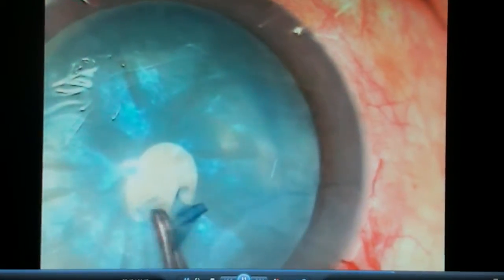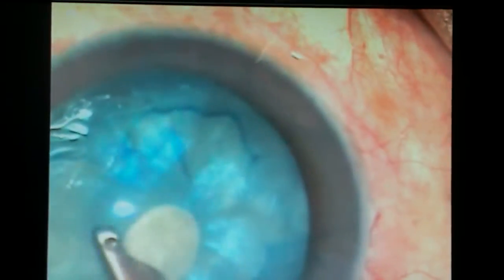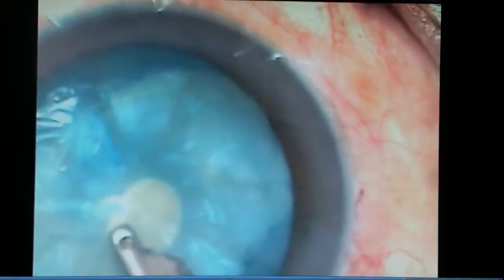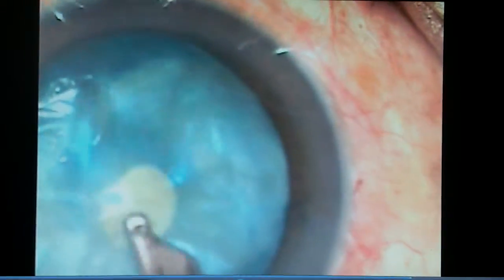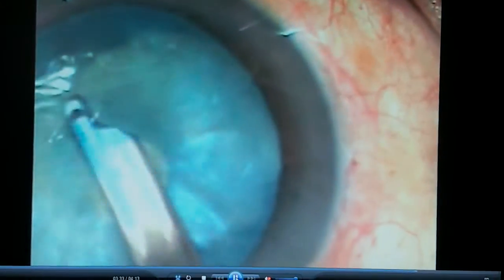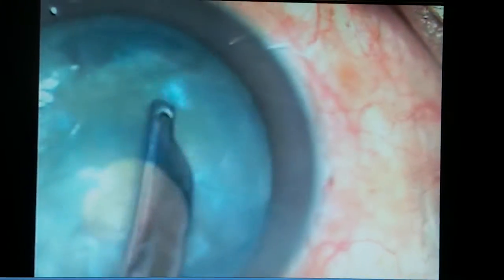Now I release the high intralenticular pressure like this, squeeze out the oily fluid, and aspirate some superficial cortical fibers through the small rhexis opening.